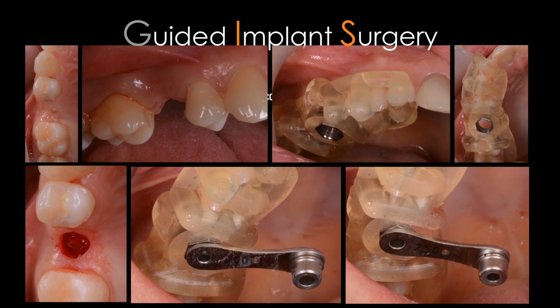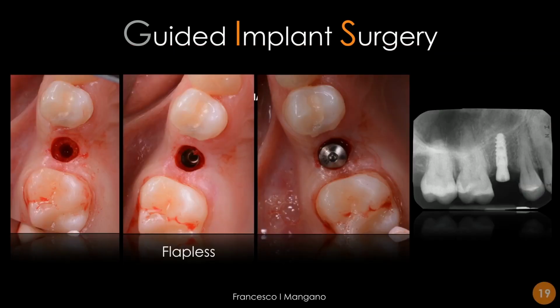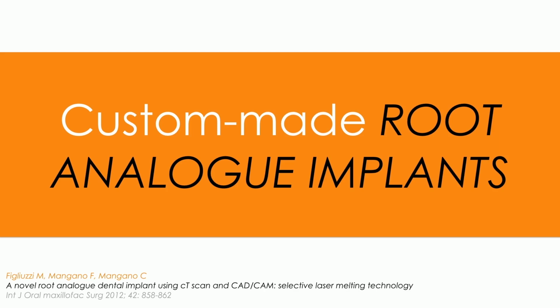We have published with Uli Oship this interesting report on our cases, very simple cases realized flapless, like one implant, single implant or multiple implants, through this system that is very reliable, with no issues at all during the surgery. So it's a very helpful way to use the DICOM file from cone beam computed tomography. But it's not the only way, because cone beam computed tomography, as I told you, is the door to segmentation of the DICOM file, and it's the door to computer-assisted design and computer-assisted manufacturing applications.